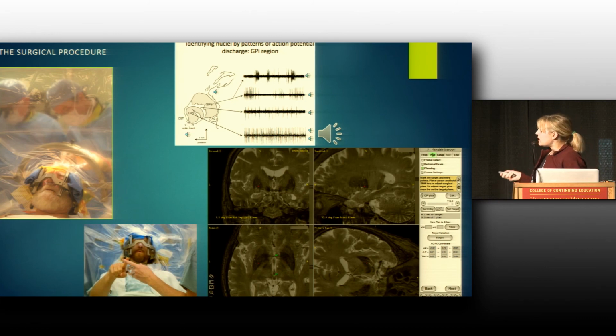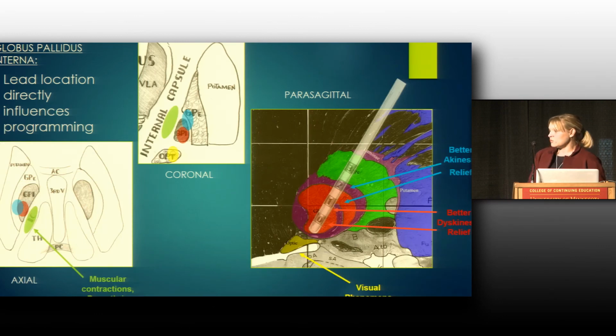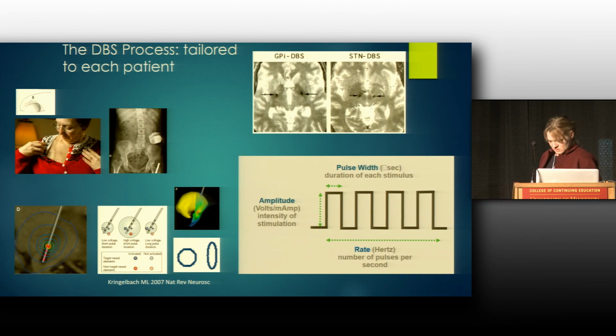So that's typical. This is from a Parkinson patient. This is the globus pallidus interna cell. And what I'll do is an exam during it, and you can hear when I'm in the arm territory, I can hear it speed up its firing, for example, or in the wrist territory. And so we need to make sure we're in the motor territory when we do this, because 1 to 2 millimeters off, and we can run into trouble.